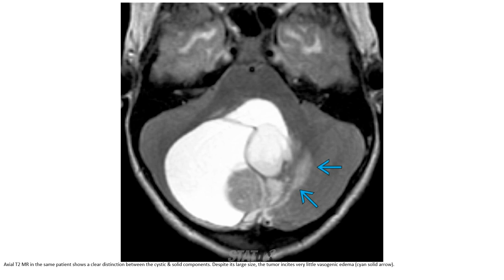This is the T2 image in the same patient, showing a clear distinction between the cystic and solid component. Despite its large size, the tumor shows very little vasogenic edema.